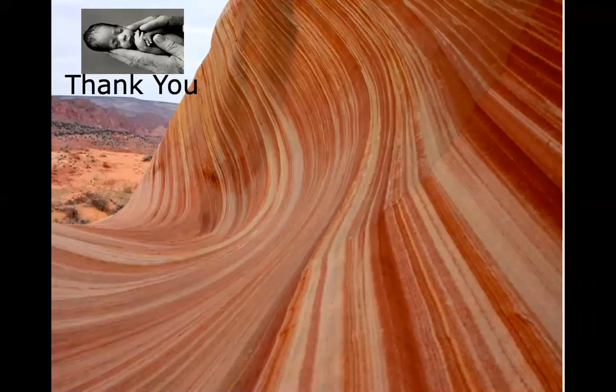Yeah. So as I said, volume control ventilation is controlled by the volume itself. That means the cycling will happen only when you reach a particular volume. But in this VG mode, it is still pressure controlled, and you are adding only volume to it to change the pressure to get that much volume. So it's still pressure control. It is not volume controlled. Volume controlled ventilation is absolutely volume control when you keep the volume as the control. So that's how it is different. The pressure control ventilator just has a volume guarantee added to it.